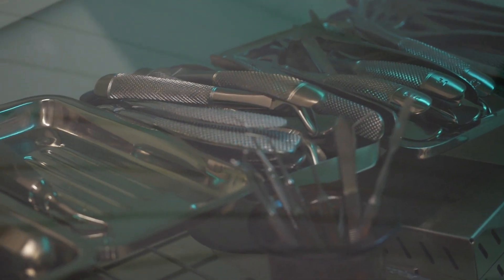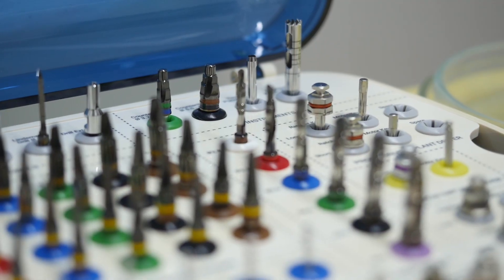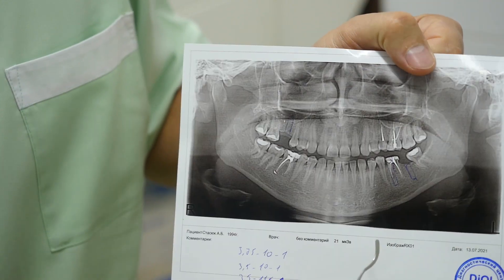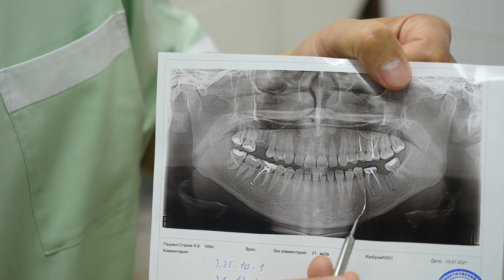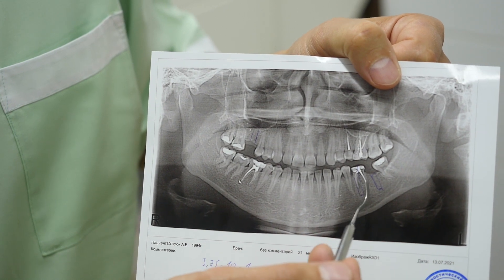This video will showcase SpongeZenGraft as a void filler at immediate implantation for a post-extraction socket. No membranes were used. The patient is a young woman; however, since the first molar started to develop inflammation and granuloma, an extraction decision was made.